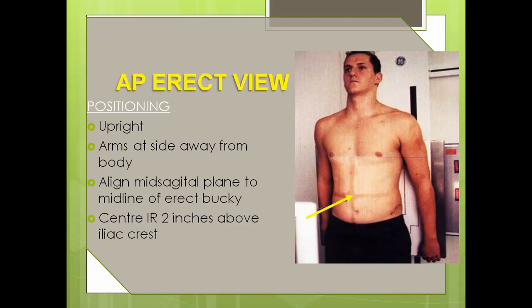Next view is the AP erect view. It will be an upright positioning. Erect view means the patient can be standing or sitting. So what is the positioning? The patient will be in a standing positioning. You can see both arms will be kept away from the abdomen area.